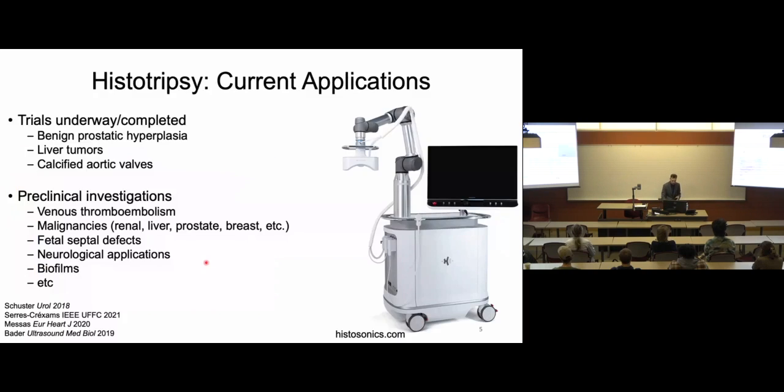And so when you use focused ultrasound to generate bubbles to mechanically ablate tissue, it's a therapy called histotripsy. For those of you who are Latin buffs, histo is soft tissue. Tripsy means breaking down. It's analogous to lithotripsy, used to break down kidney stones. As an under-investigation therapy, it's been around for about 20 years now. It's been developed for a number of different malignancies, clotting, tumors, fetal septal defects, et cetera.